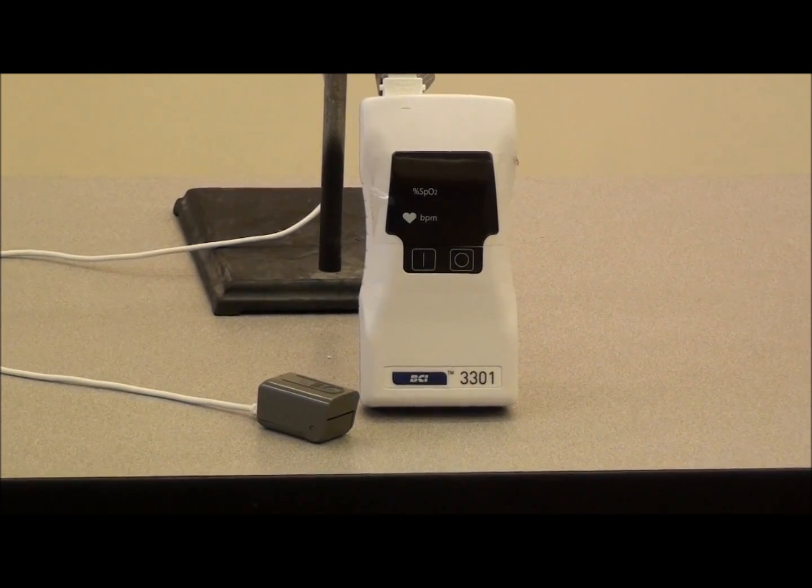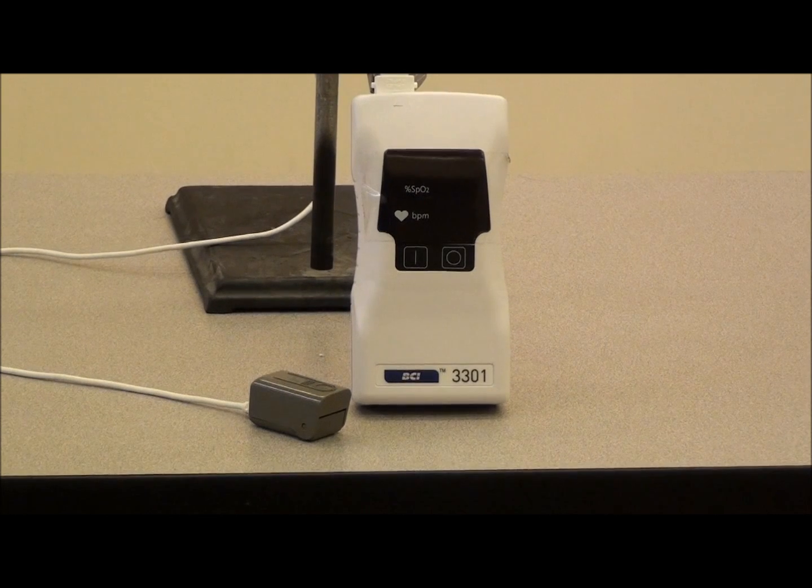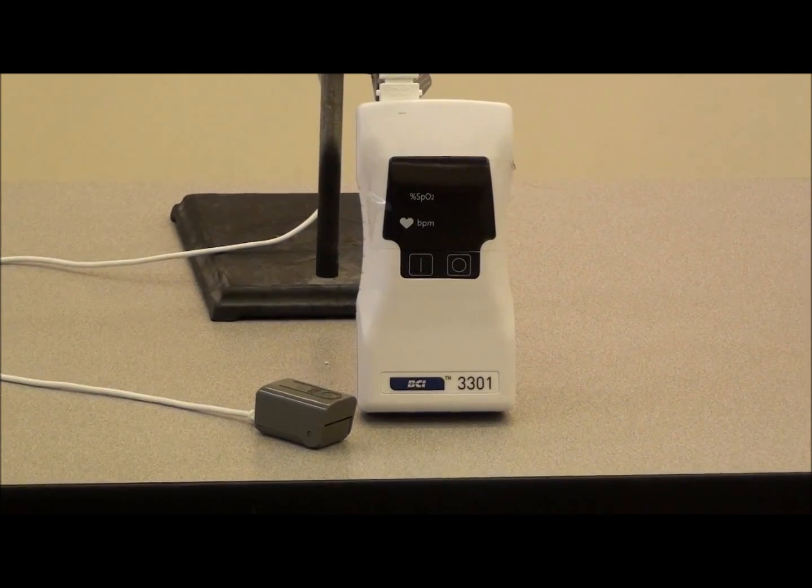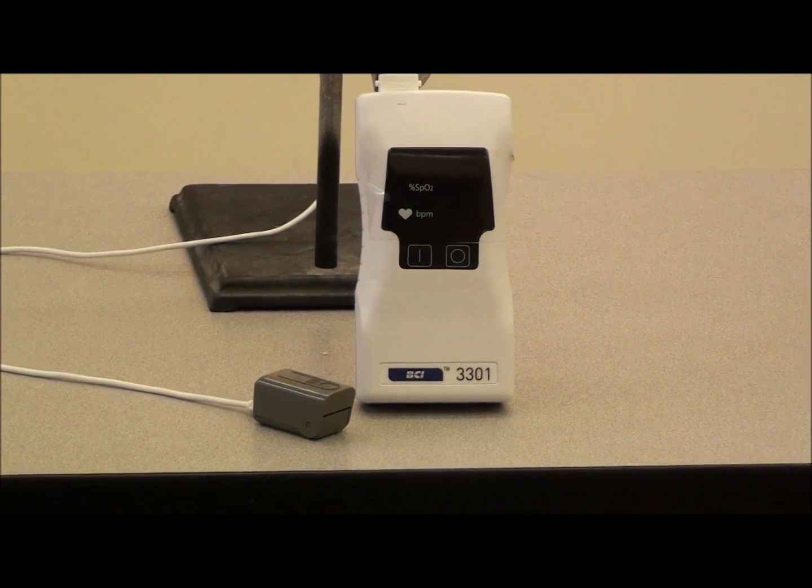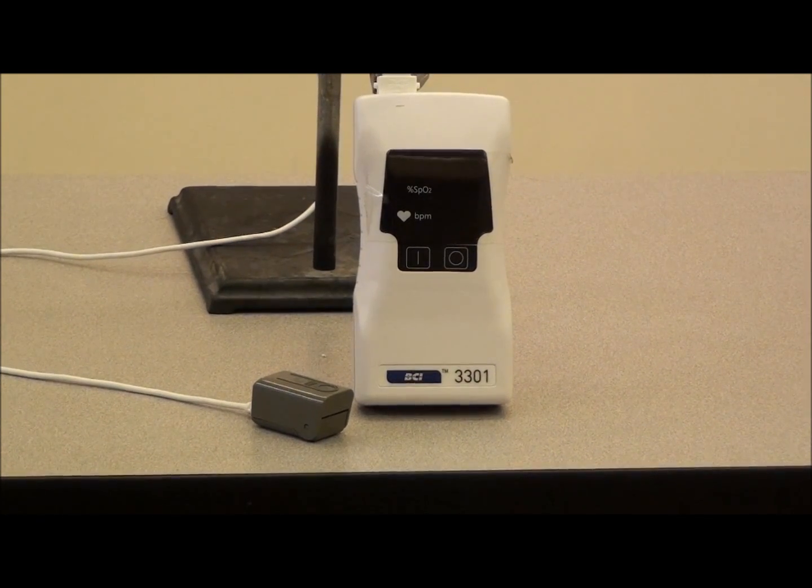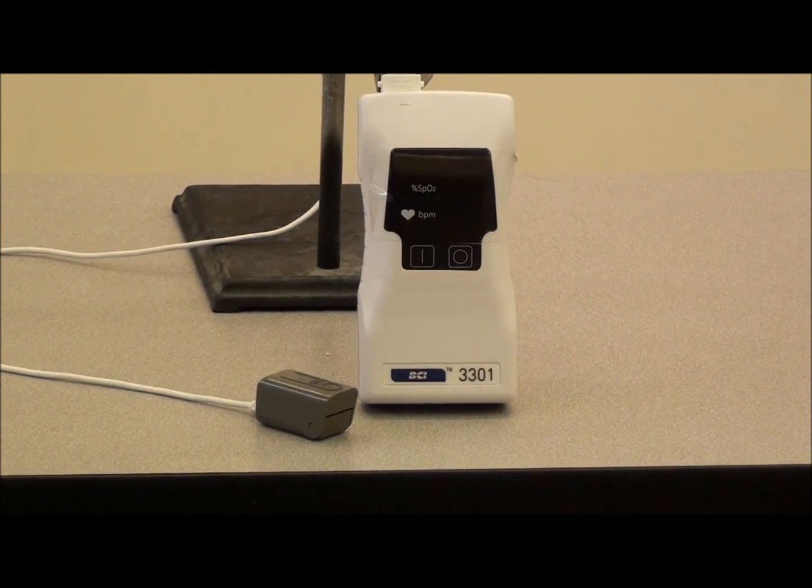Pulse oximetry is based on the fact that oxygenated hemoglobin has a different absorption spectrum for electromagnetic radiation than does deoxygenated hemoglobin. The technique uses a sensor or probe which can be placed on the digits, ears, nose, and even the forehead.